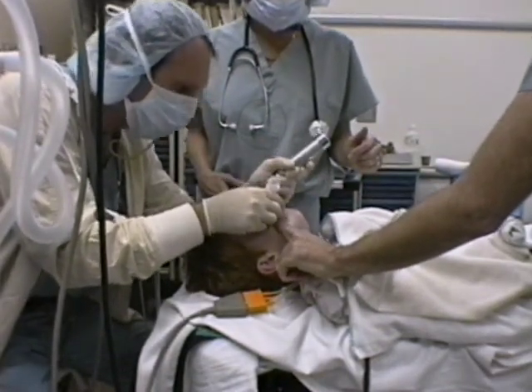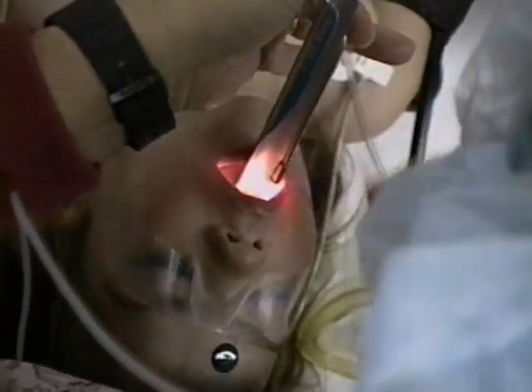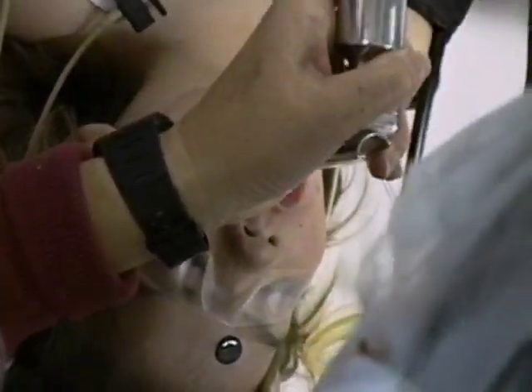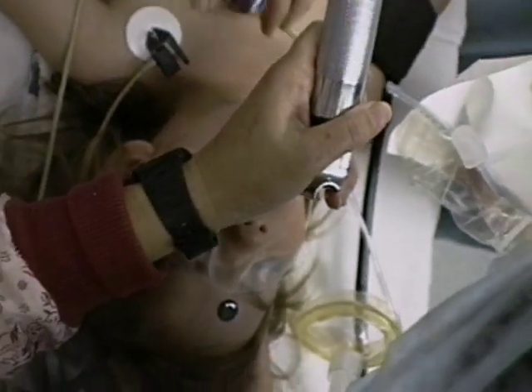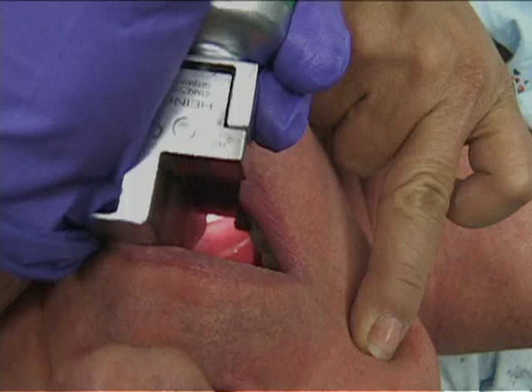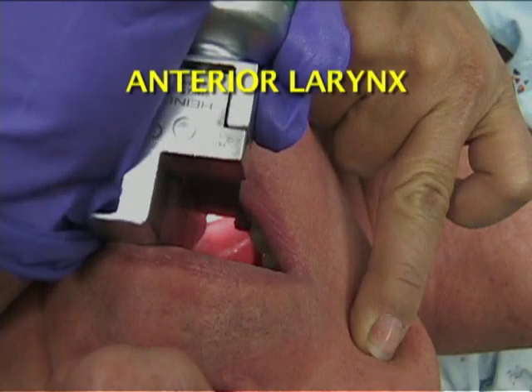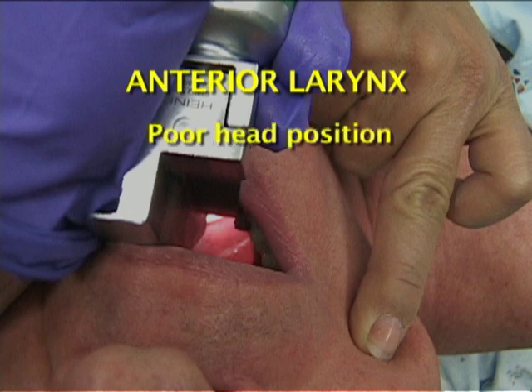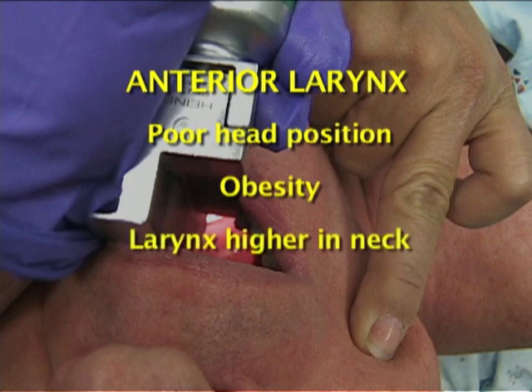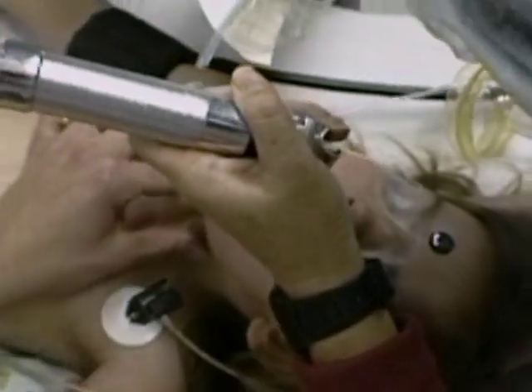Continue to hold the tube with your fingers at the lips until it's secured. Head position and movement of surrounding tissues shifts cartilages and may affect your ability to see the vocal cords. Sometimes the larynx lies anterior to your field of view during laryngoscopy. This is a so-called anterior larynx, and it occurs with poor head positioning, as well as in patients with obesity, larynxes located higher in the neck than average, and in patients with poorly developed mandibles or weak chins.